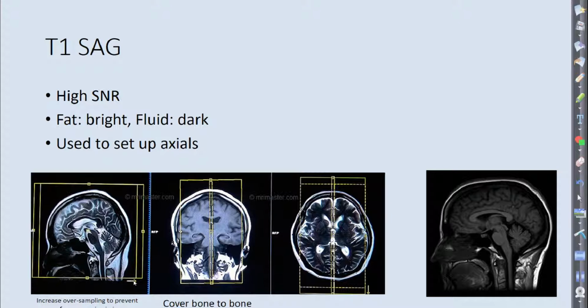Phase over. What's this arrow signify? Phase encoding direction. Yeah. Phase oversampling and phase encoding direction. Sometimes you have to increase your phase oversampling to prevent this. See how the nose is starting to creep in? It will wrap into the back of the brain. So if you see that nose wrap into the back of the brain, know you either need to increase your field of view or increase your phase oversampling. Okay? It's your first artifact you'll probably run across in that area.